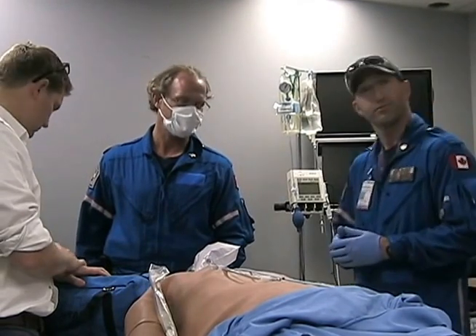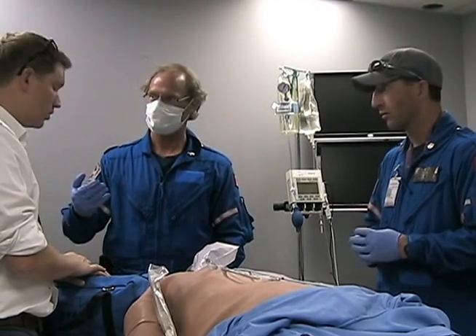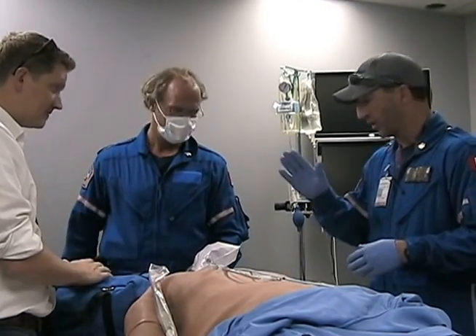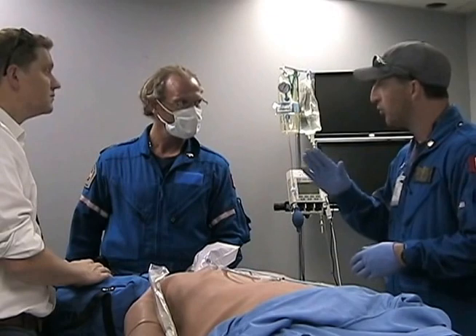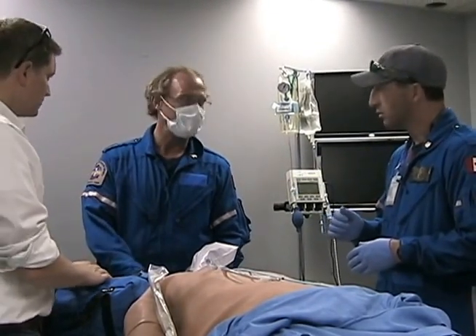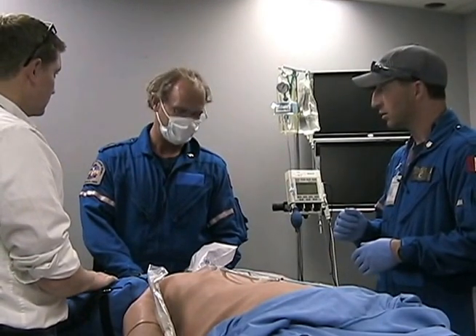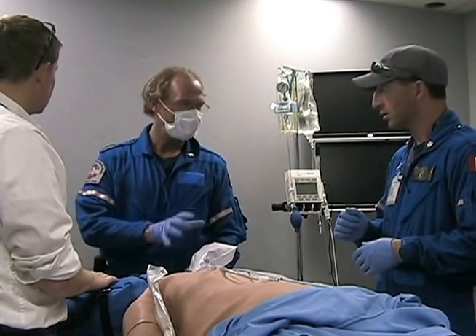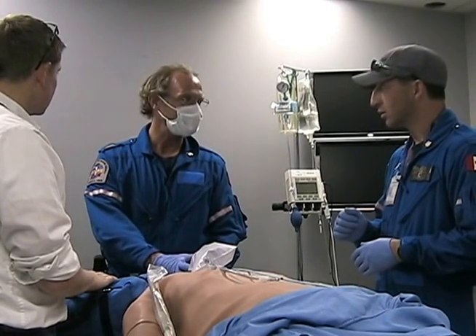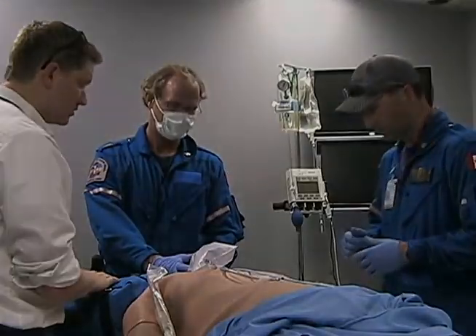Excellent. Okay, sounds like we're good to go then. Questions or concerns before proceeding? James, do you have any questions? No questions. Bruce, questions, concerns? No, the only thing I didn't hear was the SpO2 threshold that we're going to pull out. Good. Okay, great. So the SpO2 threshold, he's 99 right now. As soon as we get to 93, 94, we're going to look at potentially stopping our attempt. We're going to re-oxygenate him, get his sats back up, and then we're going to do our second attempt. Perfect. Everybody comfortable? That's great. Excellent. Good catch.